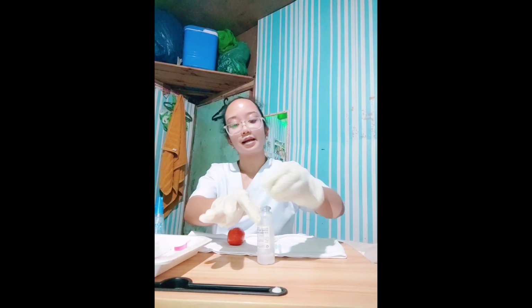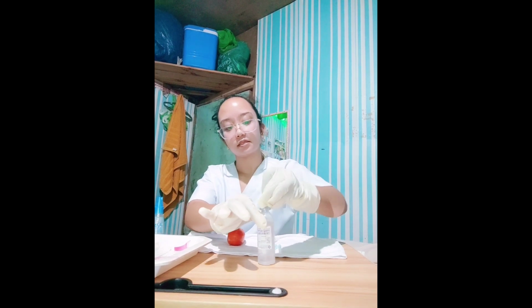Start at the center and move outward about 5 cm and allow the skin to dry. Of course, we will disinfect the vial.